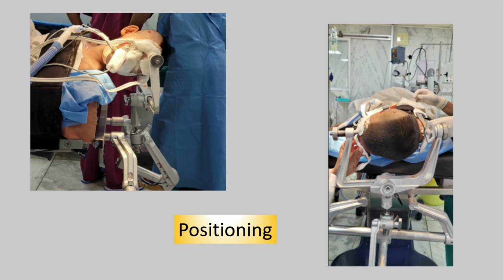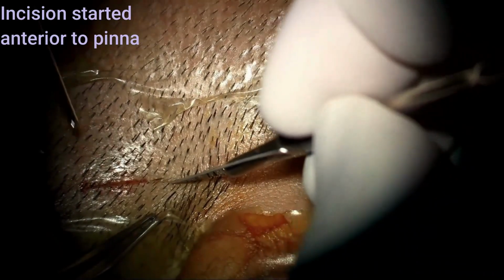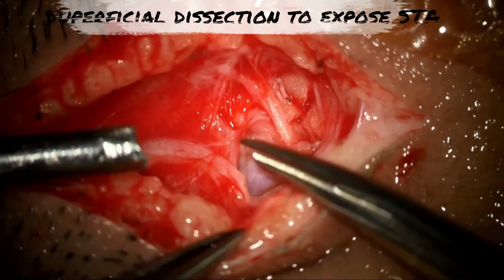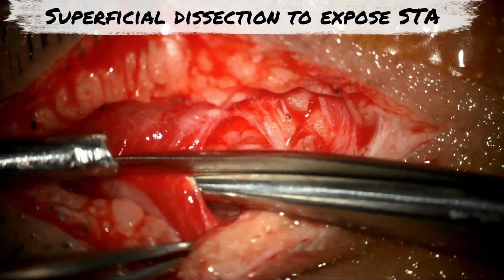The patient was positioned supine with right shoulder support and head on a Mayfield clamp with 90-degree rotation. Incision marking was done using a 26 gauge needle under Doppler guidance. The incision started proximally, anterior to the pinna. Superficial sharp dissection is being done to expose the superficial temporal artery.